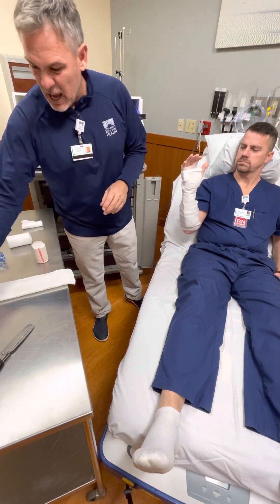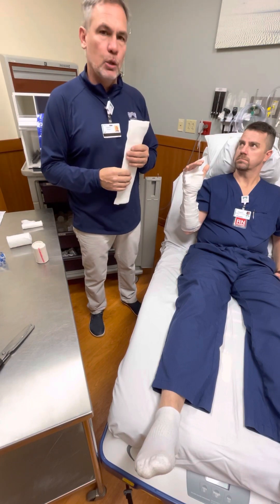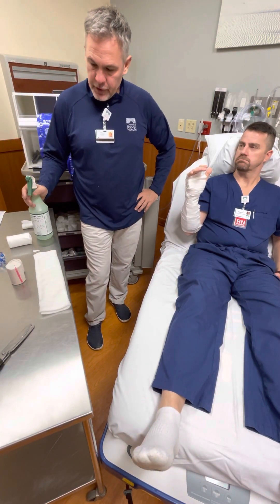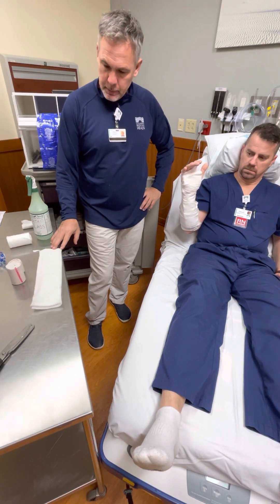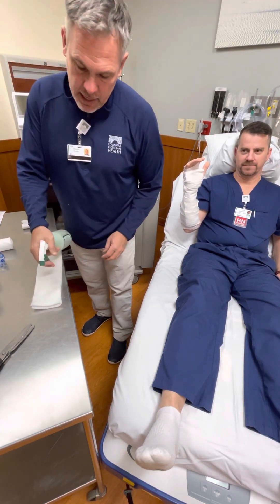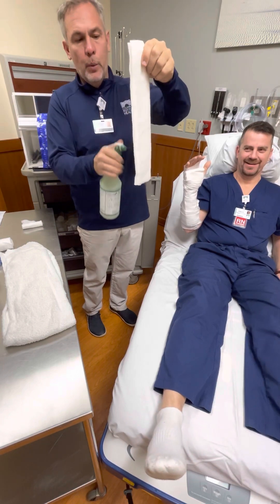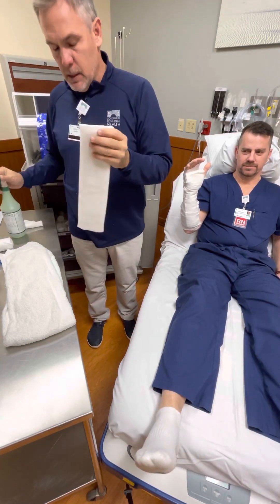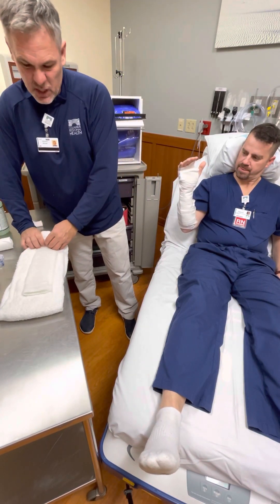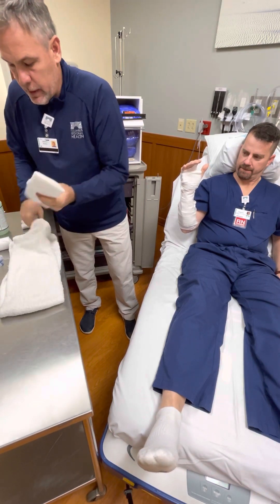Get your materials ready because you don't have a whole lot of time. Don't panic, but even if you don't provide water to this it will still get hard - it just takes a while. We're speeding the process along because it'll pull moisture from the air. We're ready to go. I've got my casting material ready and I'm going to spray. I mentioned I'll use a towel to take off any excess water. That much spray is about all we need - maybe a couple on the backside just to get it going. Rub it in, then take the towel, roll it up inside there, squeeze it pretty tight, roll it out. That's basically enough.